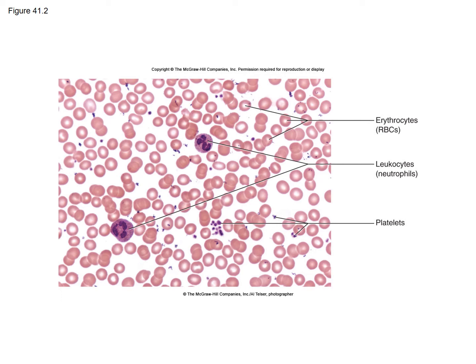This image shows the blood components: the erythrocytes, red blood cells, erythro meaning red, and leukocytes, white blood cells. This is the neutrophil, which is the most abundant out of the white blood cells. And the blood platelets, the ones you see right here, are for blood clotting. If you don't have these platelets, even a small wound can bleed forever. So blood platelets are very important for blood clotting and stopping bleeding.